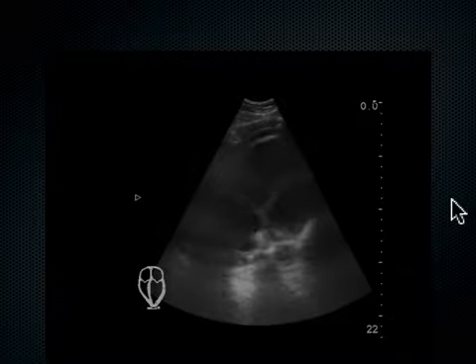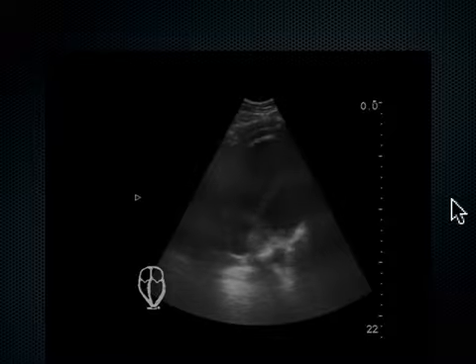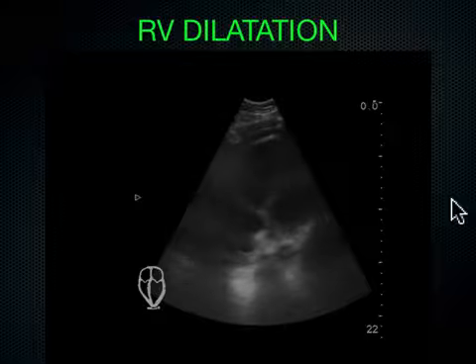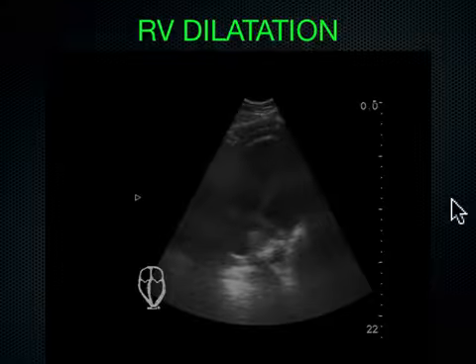So in this clinical setting of an external fixator on this young guy who's in cardiac arrest with a large RV, we pushed thrombolytics, and 2 hours later, the patient was upstairs in the ICU, extubated, eating dinner. An employee of the hospital, so it made a big deal and all that stuff.